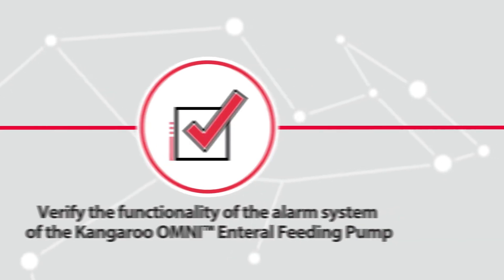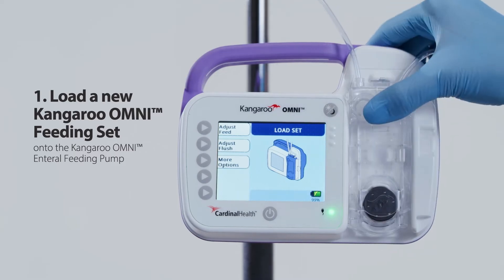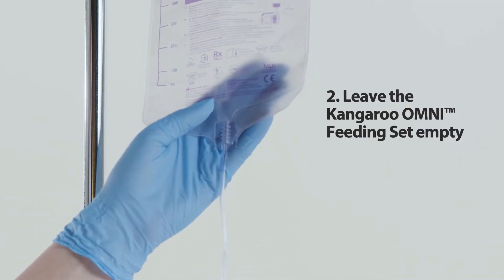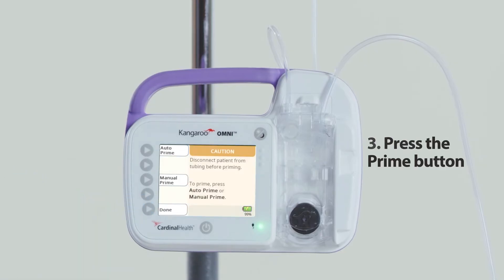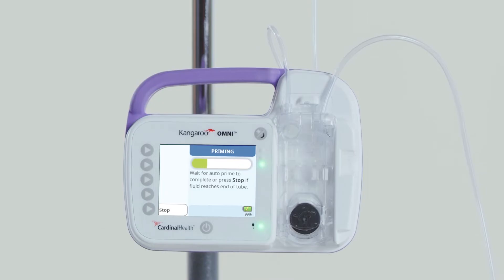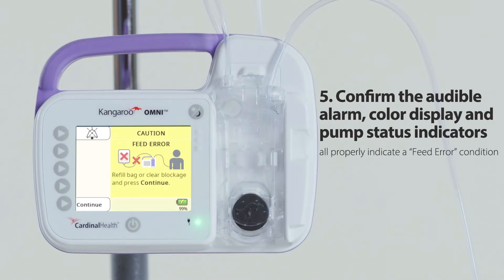To verify the Kangaroo Omni alarm system is functioning properly: first, load a new Kangaroo Omni feeding set onto the pump. Second, leave the feeding set empty. Third, press the prime button. Fourth, run auto-prime. Upon priming, the pump will detect a feed error condition and alarm. Fifth, confirm the audible alarm, color display, and pump status indicators all properly indicate a feed error condition.